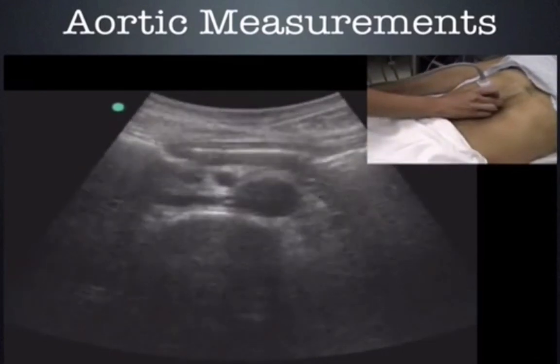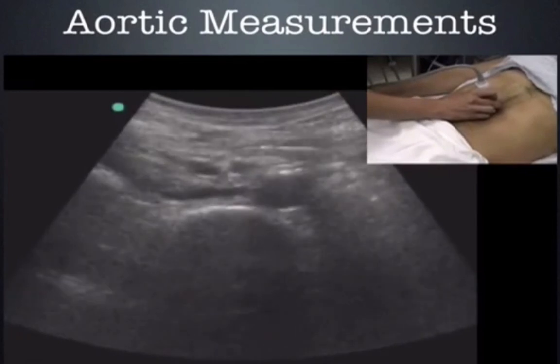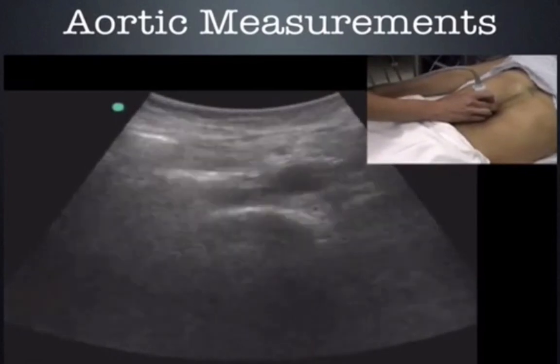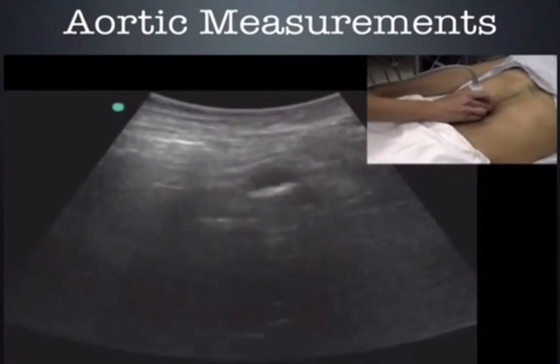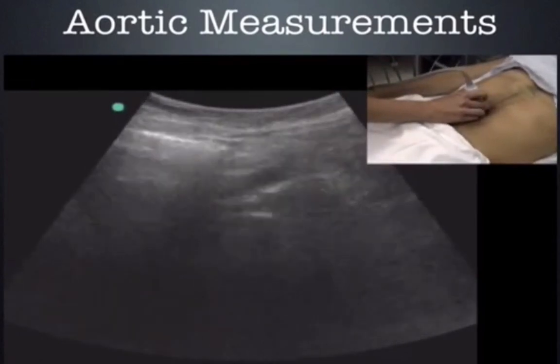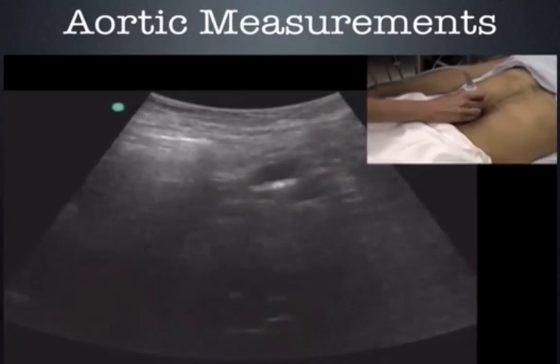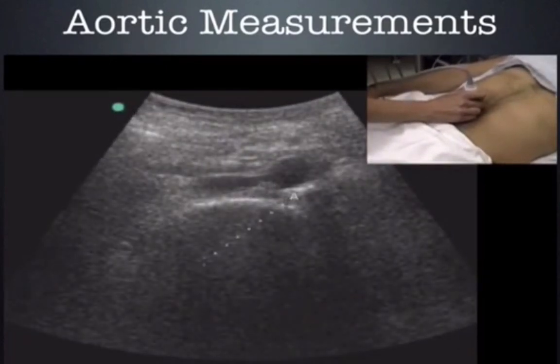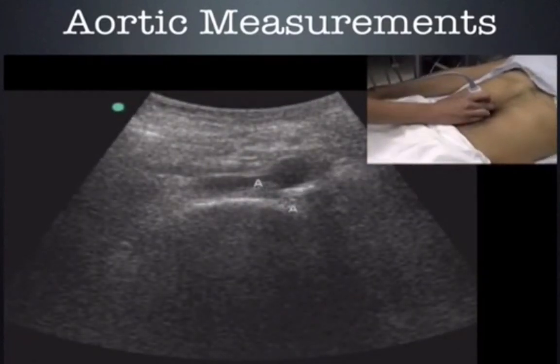Then, we're going to go down to the bifurcation and then come back up another one to two centimeters. There's the bifurcation. So let's come back up and freeze the image and measure outer wall to outer wall.